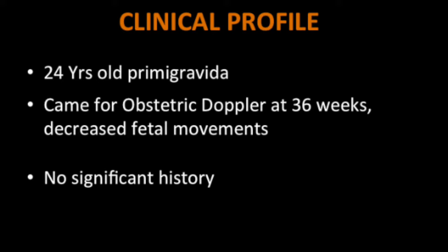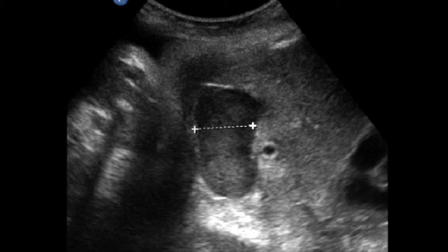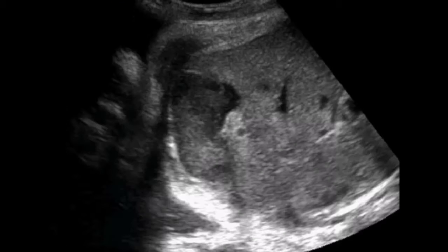All the parameters in the Doppler were normal. But in the fetal mid-abdomen, what one could see was these dilated bowel loops — the small bowel loops — which had some internal echoes inside. This is an abnormally dilated bowel loop. The measurement was about 12–15 millimeters.